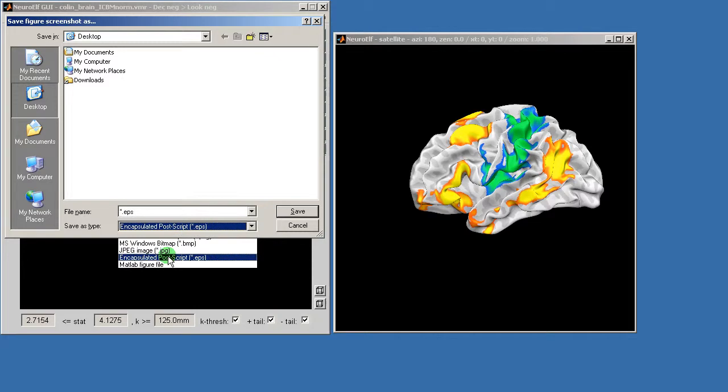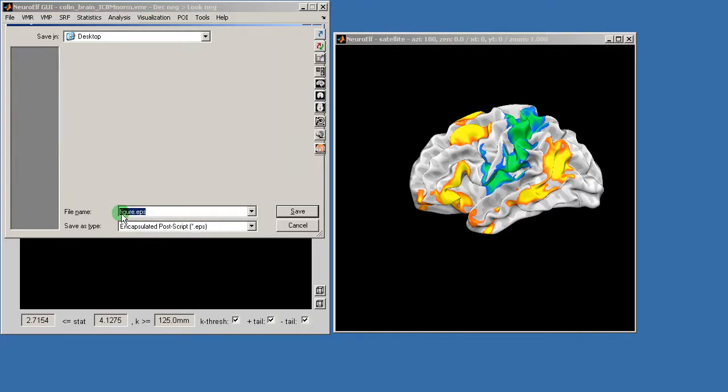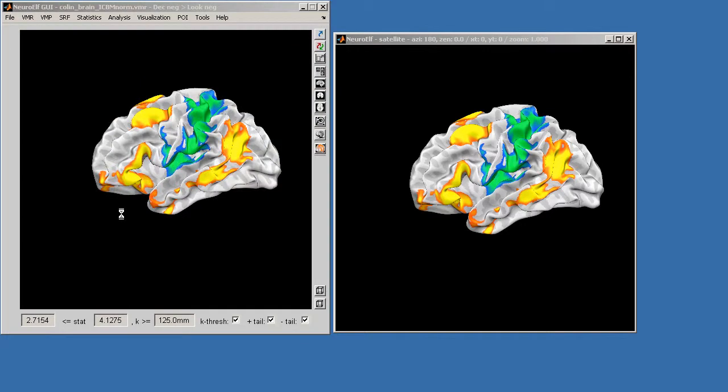And if I then select save as type encapsulated postscript, this allows me to then save a file format that contains the actual position of the vertices with their color, which then allows for much higher quality rendering.